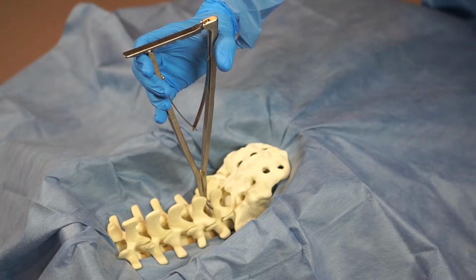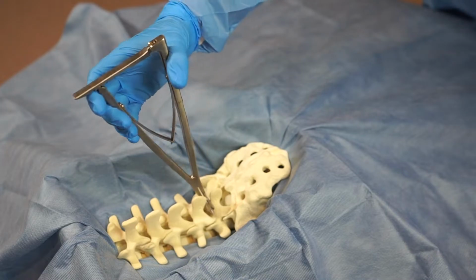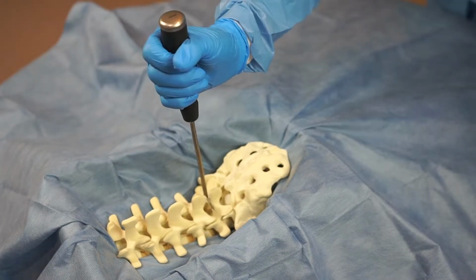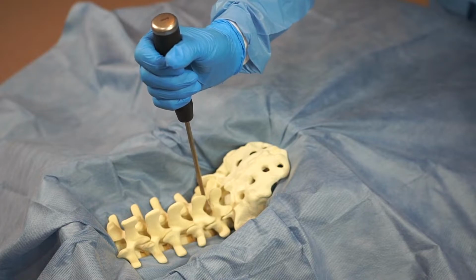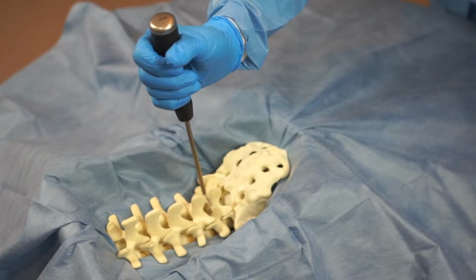Once the appropriate implant size has been determined, the universal rasp can be rotated cephalad and caudad in order to decorticate the spinous process. Optional aggressive rasps are available to further decorticate and open up the interspinous space prior to placement of the Stabilink implant.